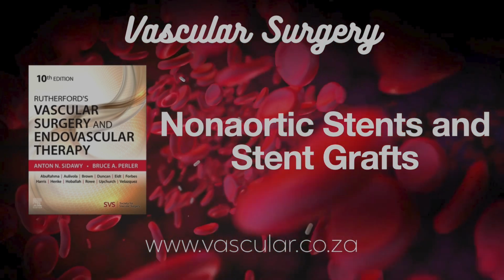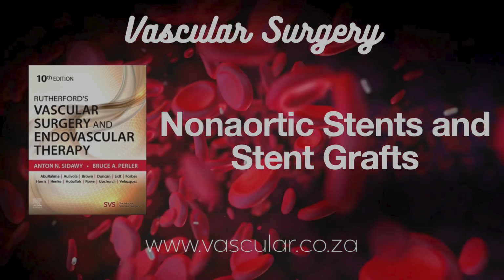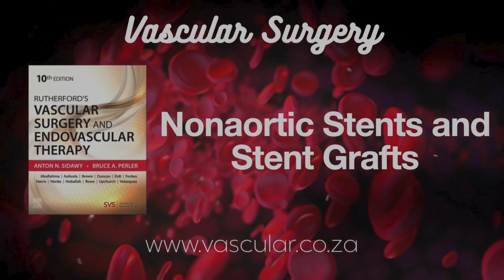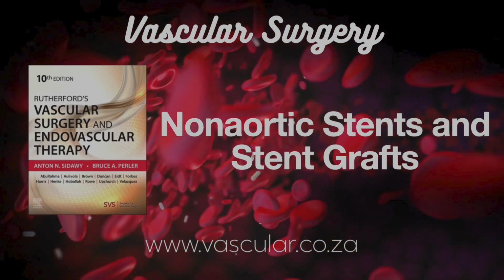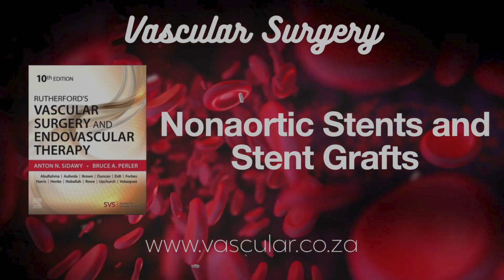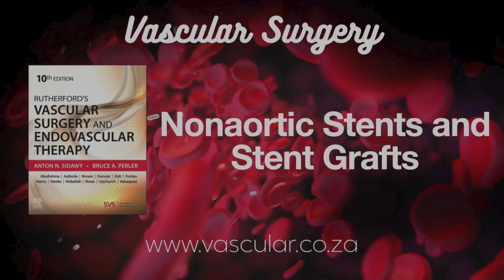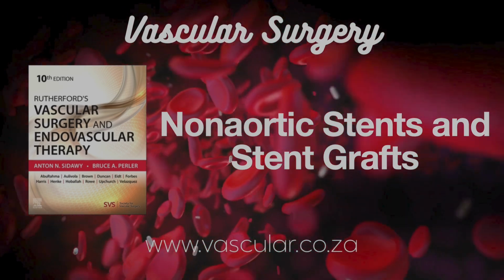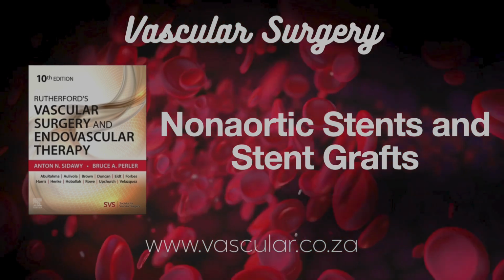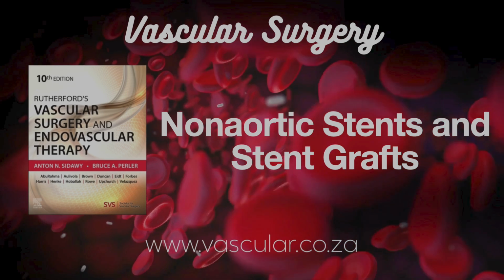Different materials, different ways they open up. Let's compare them. Radial force, the outward push. BE stents generally have higher radial force. They really push outward strongly right away, which is great for plastering down plaque or dissection flaps. And SE stents? Lower initial force, but it can increase as the stent gets embedded in the wall over time. Okay, what about flexibility? That seems crucial for navigating bends. Big difference here. SE stents are way more flexible, much better for getting around corners in twisty vessels. Whereas BE stents are stiffer. Much stiffer. They're mounted on a balloon, remember? They don't bend well and can even get squashed or deformed in arteries that move a lot.